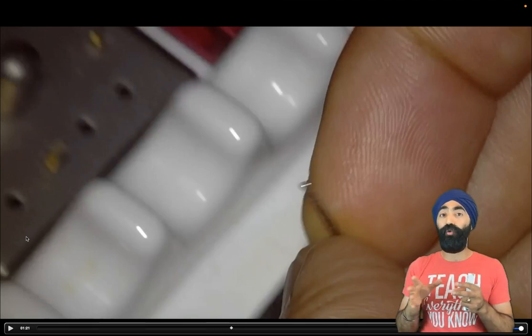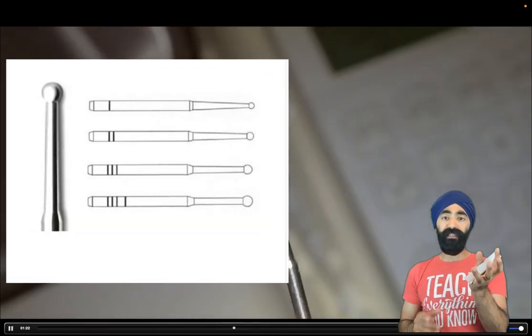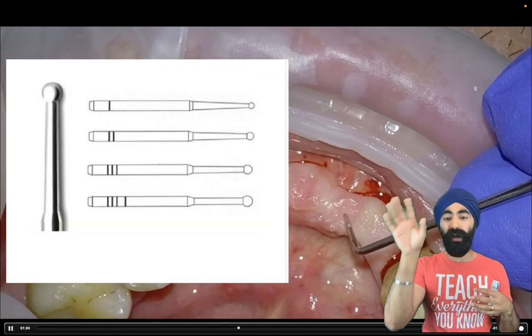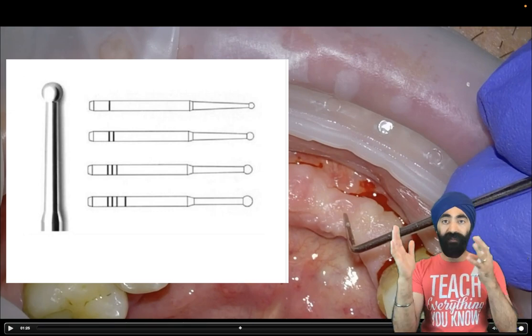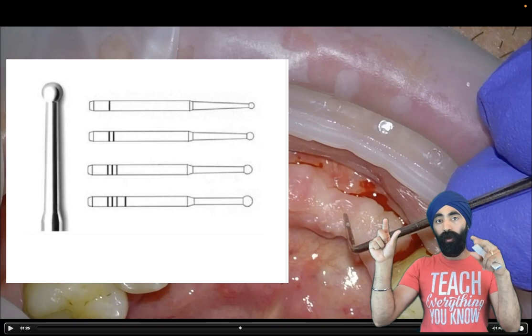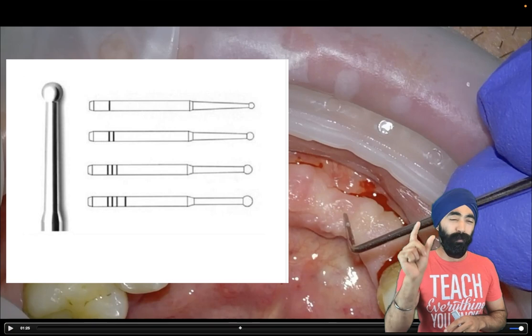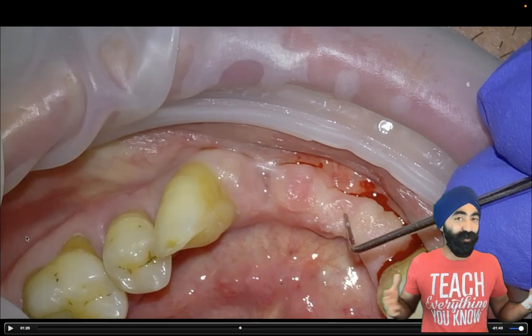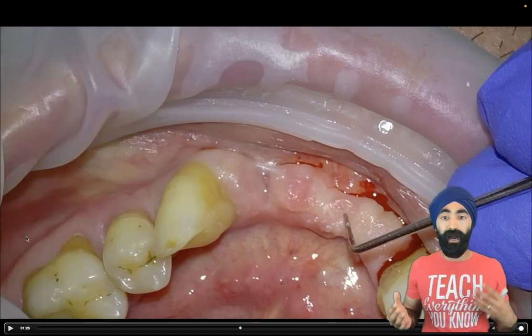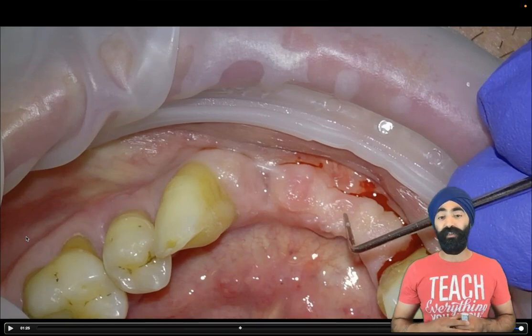Therefore, I opted to do some adjustment of the soft tissues using my favorite burr for soft tissue adjustment — the Thermocut burr. If you're in the market for these, I'd get the assorted pack. You get four or five different sizes — small ones, a medium one, and a big one. So for different papillae and different areas of soft tissue, you can use the correct size Thermocut burr. They last forever because there are no diamonds on them and they're dirt cheap. So I would just invest in a set of Thermocut burrs for this kind of scenario.